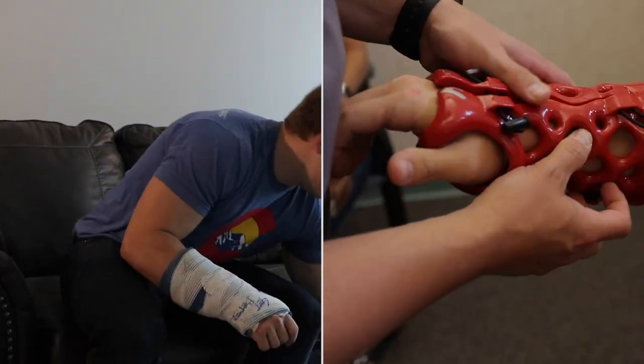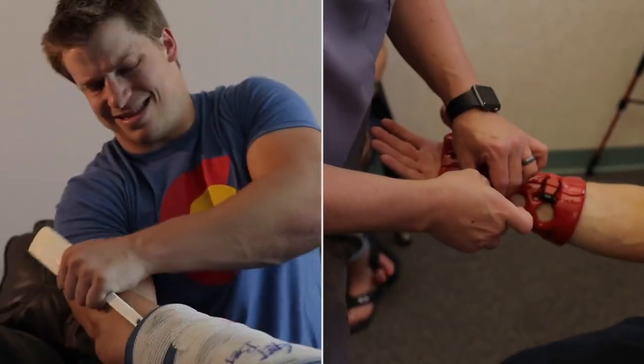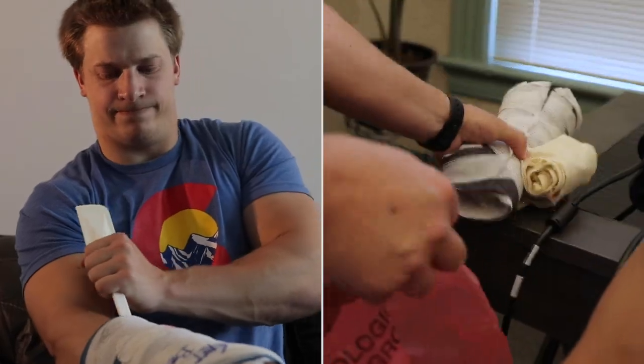The patient is then able to get a cast that is just more comfortable and easier to use. ActiveArmor is a fantastic example of how to use new technologies that are coming around to enable new products that are possible.